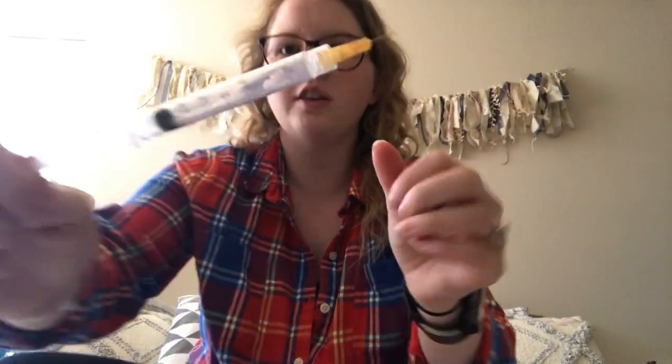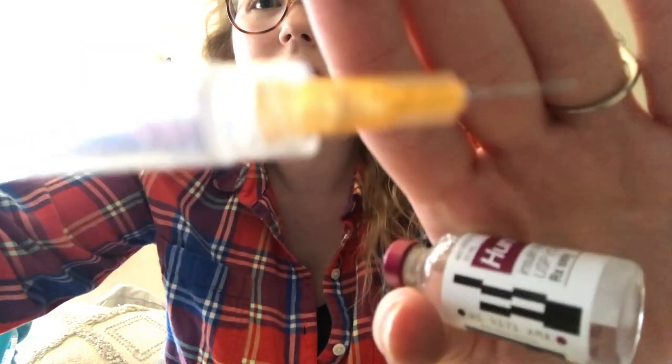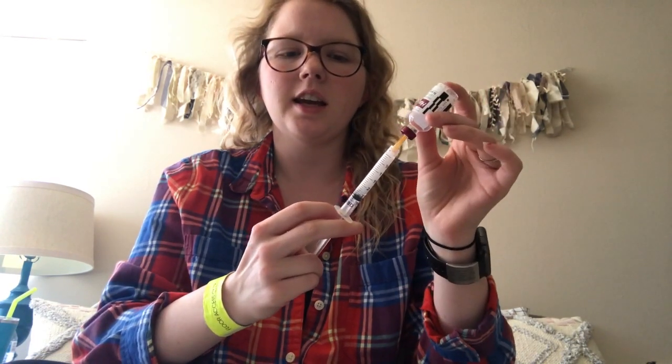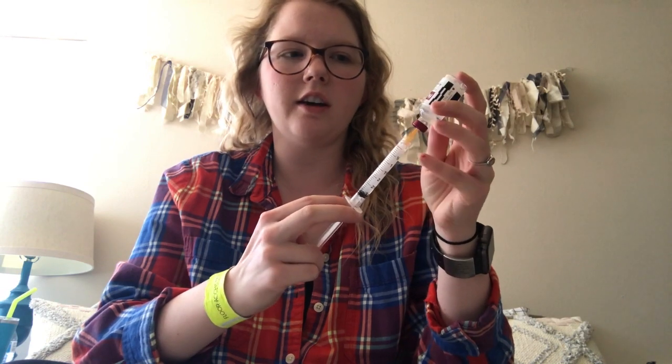You can see the needle right there — that's going to go inside the vial. I push the needle in and push all the extra air in, then I'm going to pull back and it's going to suck all the insulin out of that vial into this tube right here.